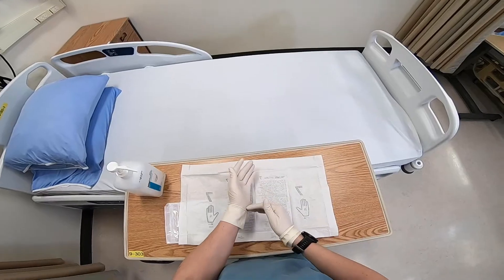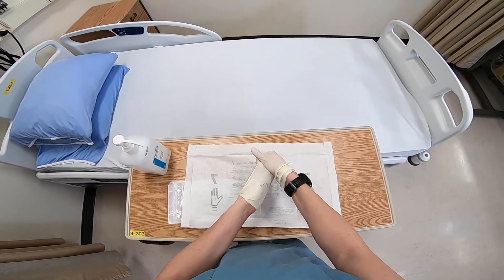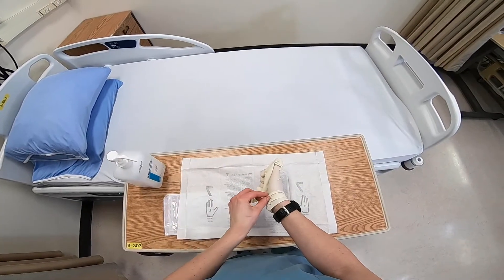To doff sterile gloves, hold the outside cuff of one glove and gently pull the glove off inside out without touching your wrist or skin. Hold it in your gloved hand.